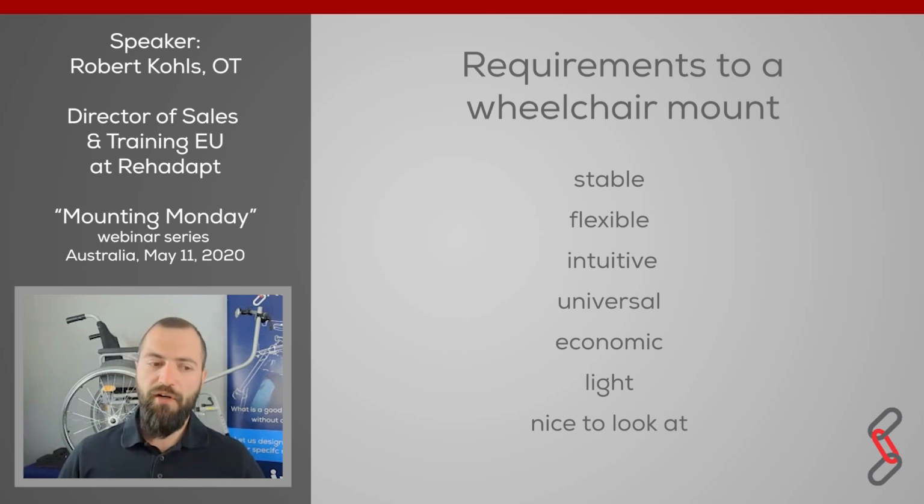And it must also be very, very light, because when we are having an AAC device with a total weight of 3, 4, 5 kilograms that will hold onto a very, very high position on a wheelchair that is maybe 60 centimeters away from the face of your customer, and when the entire mounting components are extremely heavy as well, then there will always be a risk that the wheelchair could tip over to one direction when the customer is not sitting anymore in his wheelchair.